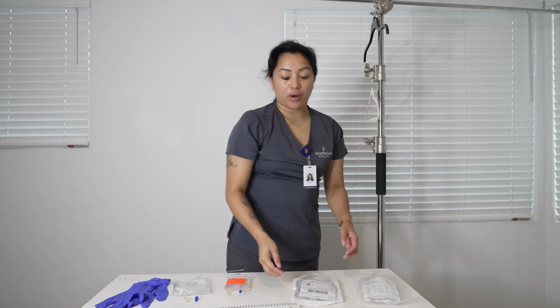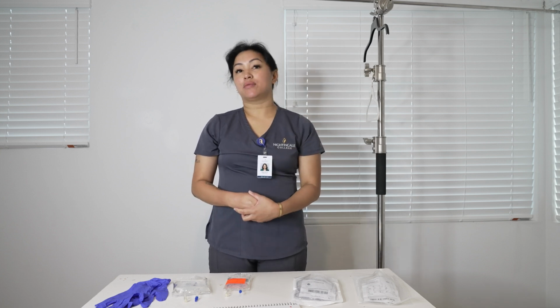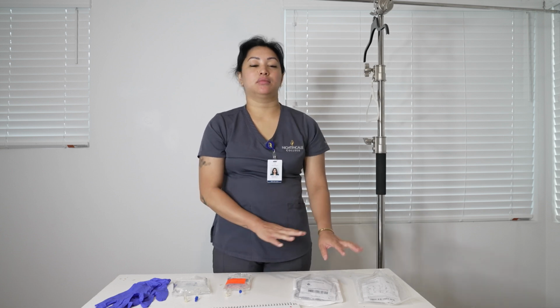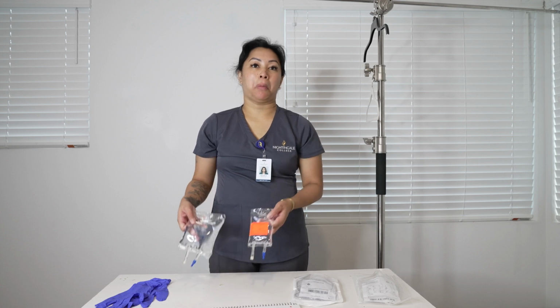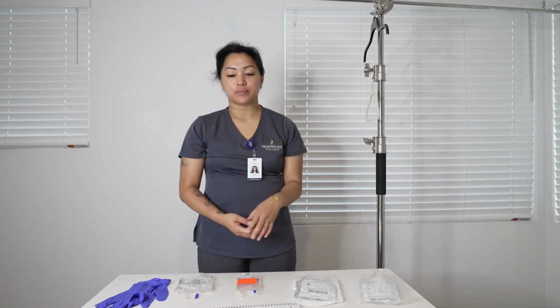These are my last pair. I already used them on my prior skills video. I tried to get most of the liquid and medication out, but here are my last ones, and these are my last ones too. And then I have my IV pole. All right.